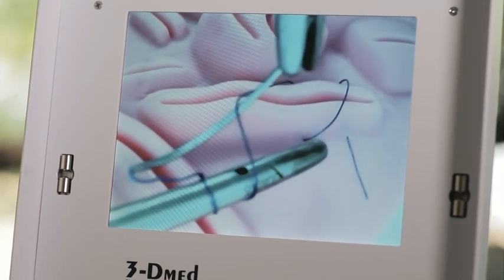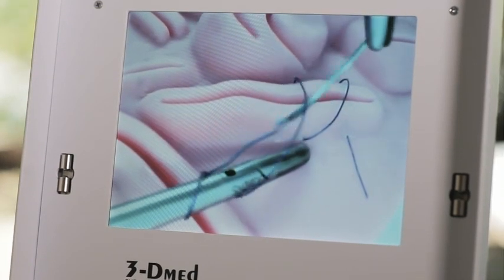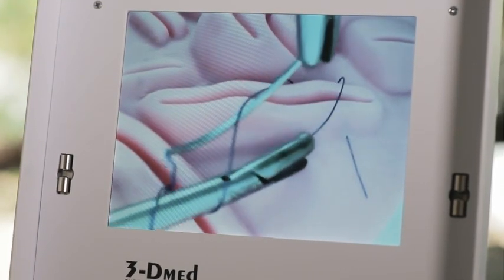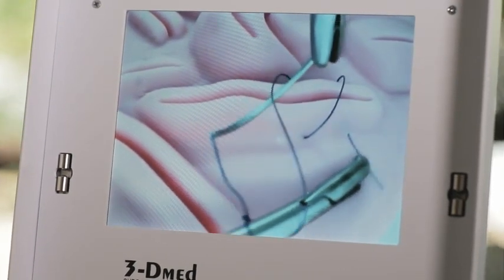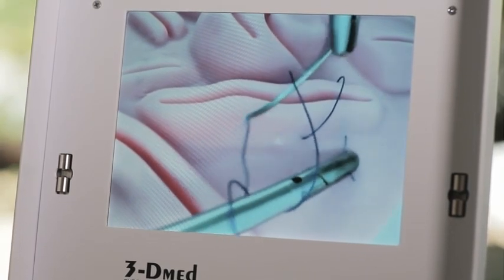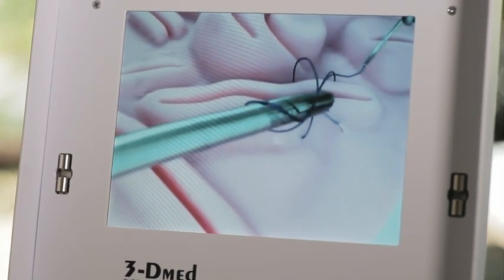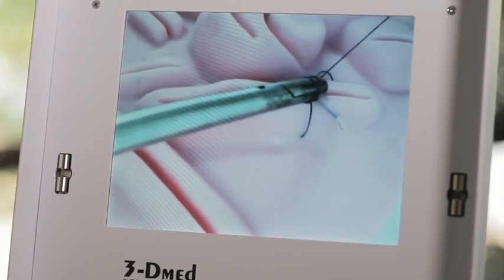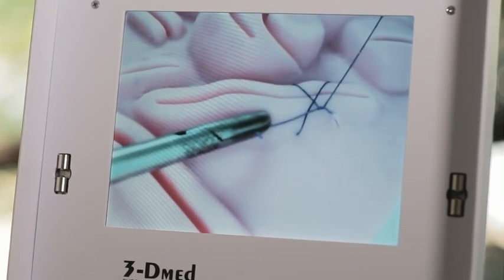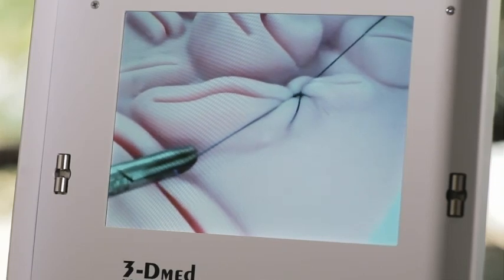This will allow me to use the needle to wrap the suture around the needle driver. I'll pull back to control where the wrapped suture goes, keep it on the needle driver, then move forward and pick up the loose end. I will pull down the length of the needle to disgorge the knot and pull away with the needle driver. There we have tightened it.